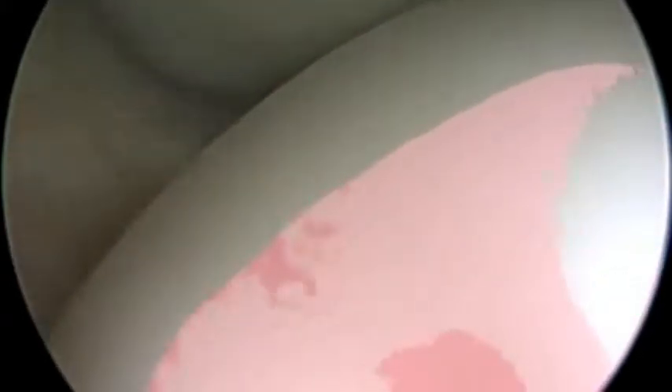Here we're looking at the cartilage with an augmented reality device, and you can see flashes of red which indicate chondromalacia, or soft cartilage, which is often seen in these patients. Here again we have re-balancing of the patella, looking at the top.